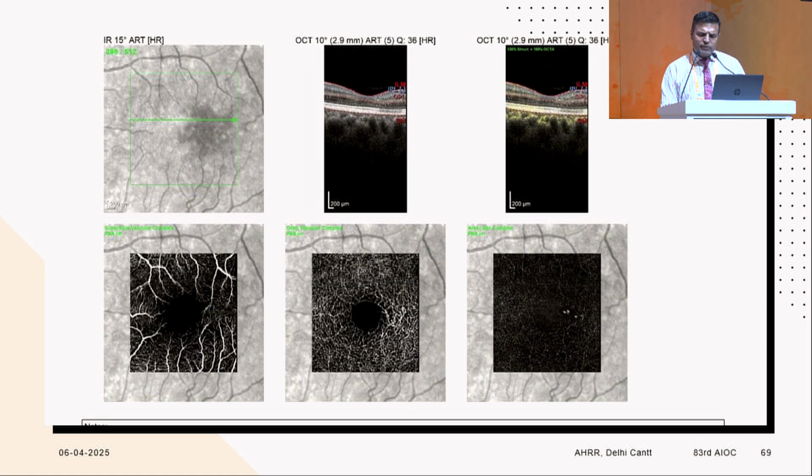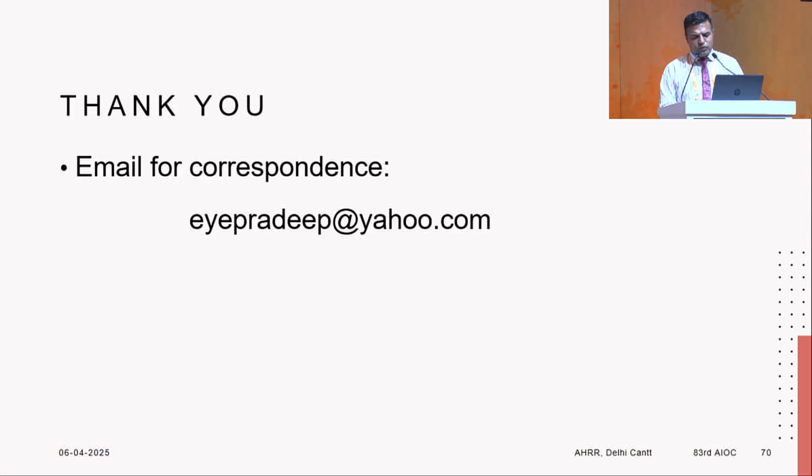We still did not believe that the patient had developed MNV, though the patient did complain of increasing metamorphopsia. Three months after that, you are able to pick up these hyperreflective signals in the avascular zone, the metamorphopsia is increased, and these patients do respond to anti-VEGF therapy. So I will conclude: keep hunting for macular telangiectasias in your OCT angiography images.